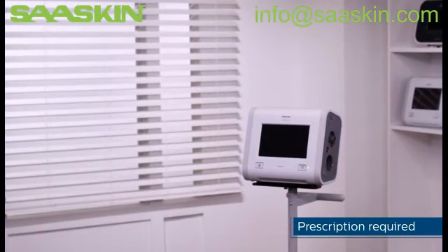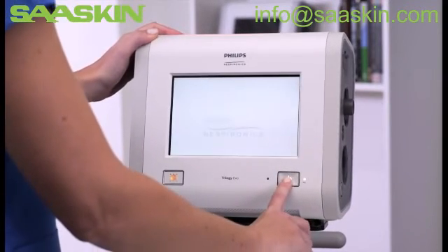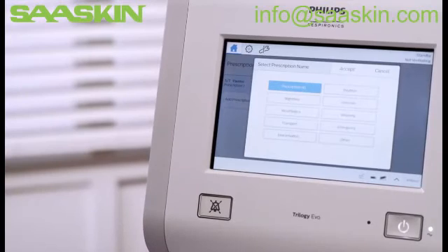Let's go through the easy setup of a new patient on Trilogy EVO. Begin by turning on the device. From the home window, tap New Patient. This clears all pre-existing patient data.